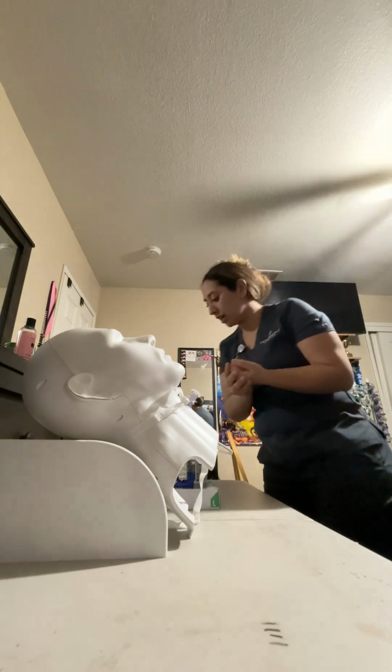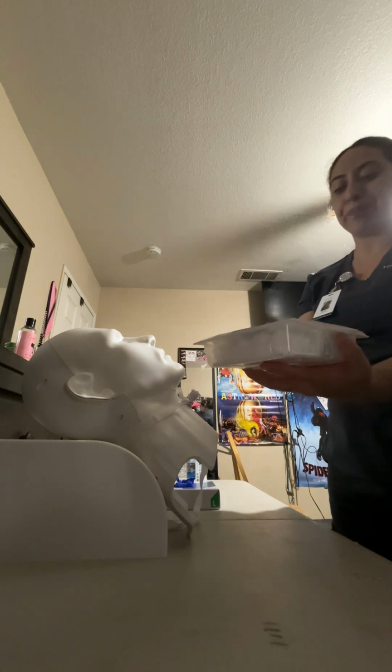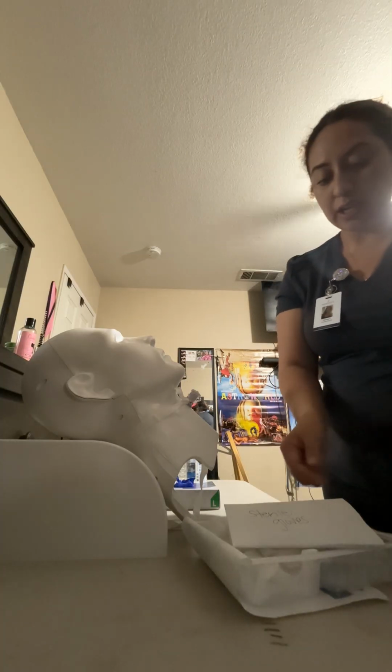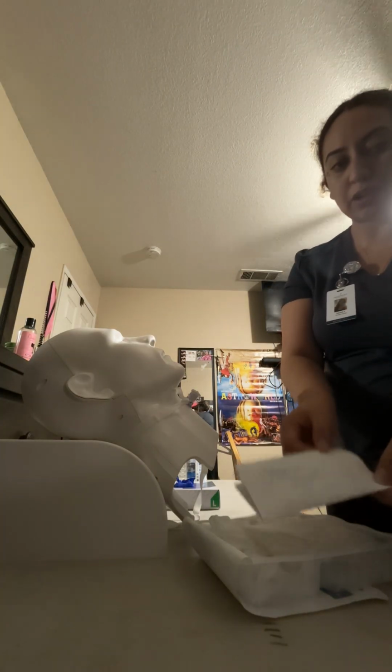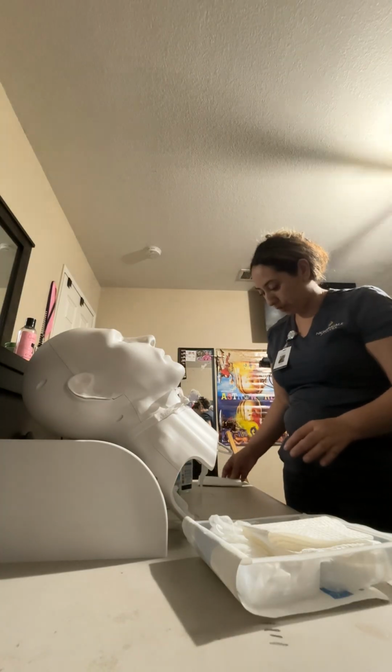So the next thing that I'm going to need for trach care is I'm going to need my tracheostomy clean and care tray. For this, I'm going to open away from me. So I will open away from the body. I'm going to place this down. So inside I have some sterile gloves. I'm going to move those to the side because I will use those at a later time.